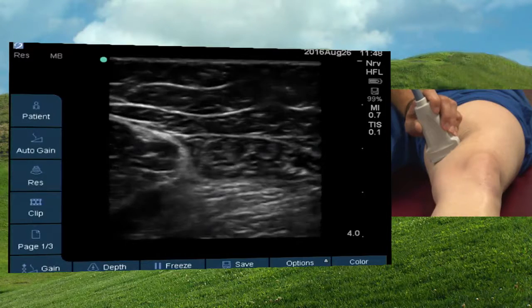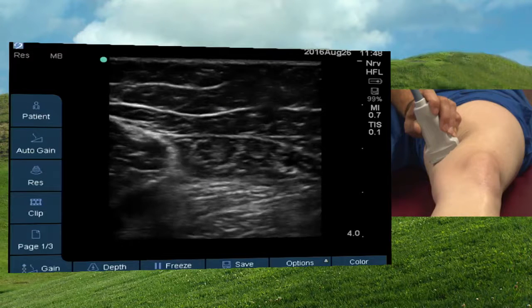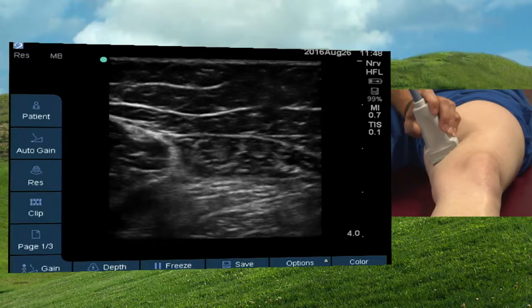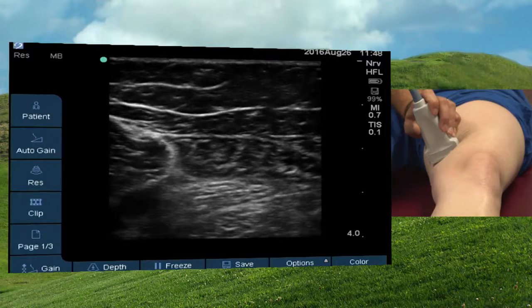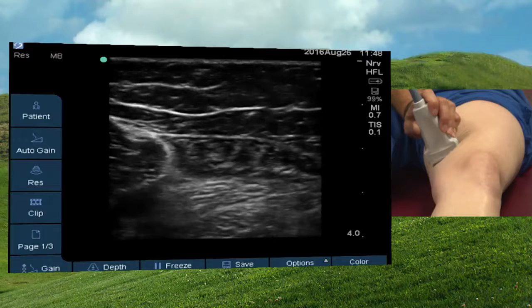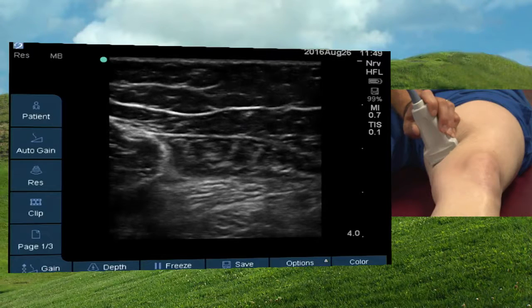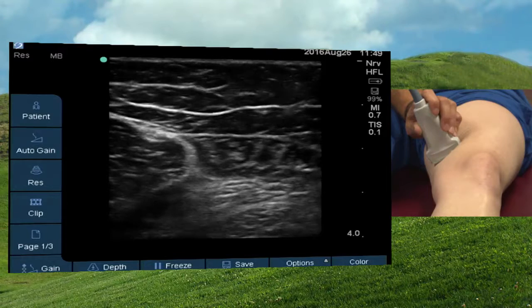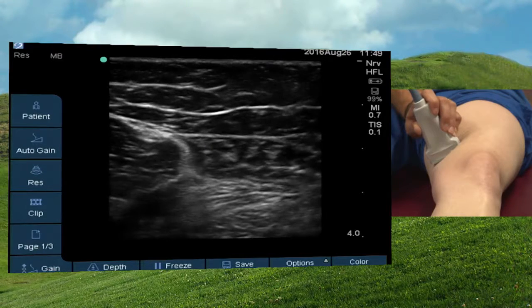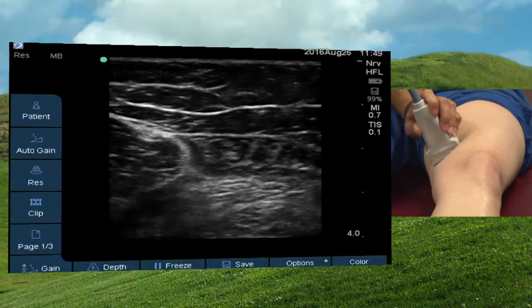You think, well, that's easy for you guys to say. Well, just by putting local anesthetic in, it causes what's called a hydrodissection and actually can a lot of times help us visualize that nerve better as we get the nerves and the muscles and other fascia separated from the nerve. So frequently we'll put a little bit of local anesthetic in and then we can actually see the nerve a little bit better. But this is exactly what we're aiming for. So when you're out there on your rotations and people are talking about these adductor canal blocks, this is the spot, this is the block.